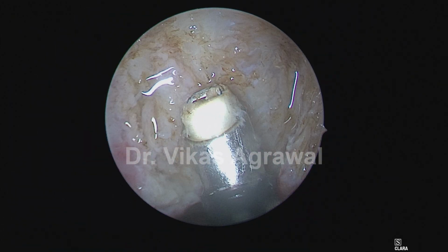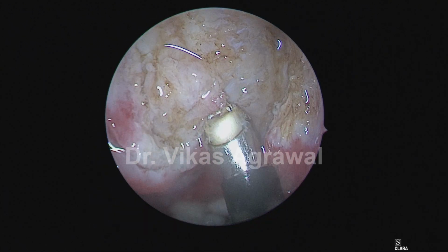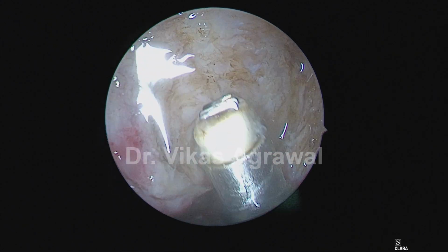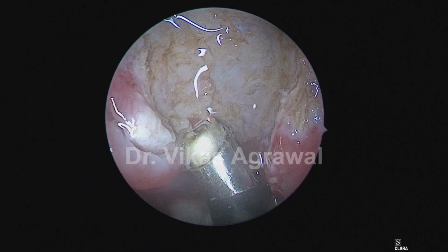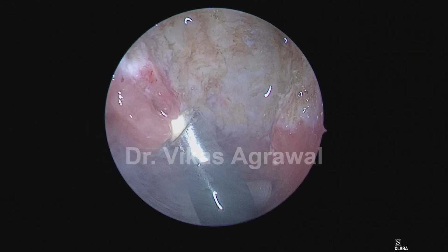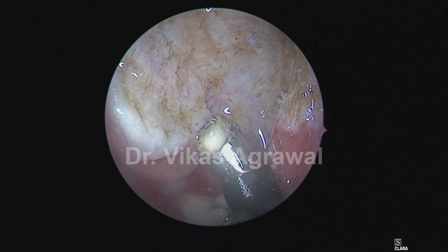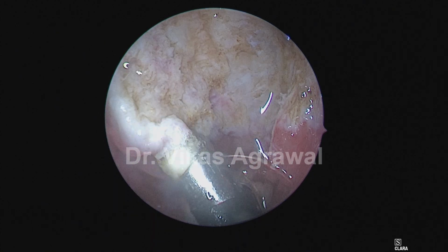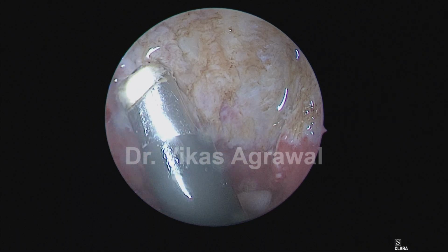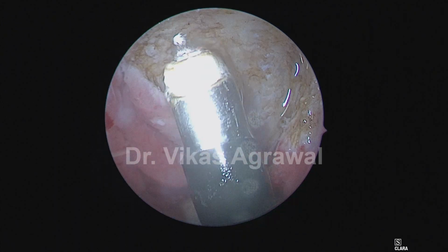You can see very, very clearly that all the lymphoid tissues have been removed, but we have not opened up the fascia anywhere. So this child should get a recurrence-free life. Obviously, allergy can still be there, but for that, a simple nasal spray should be good enough. He will not have enlarged adenoids. He will not have postnasal drip because of adenoids. He will not require another surgery in his lifetime for adenoids. We can only guarantee that much, that whatever we have done today will not give him a trouble again.